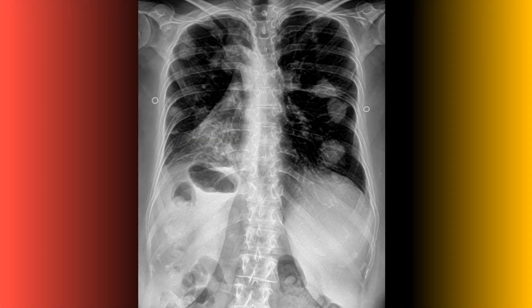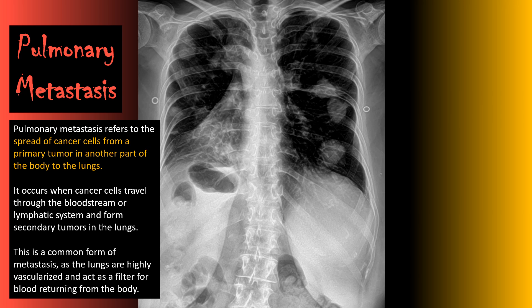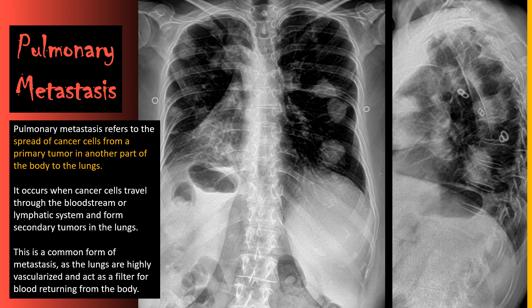In this example you should see multiple areas of increased density scattered throughout both lung fields without obvious evidence of calcification. Anytime you see that, think pulmonary metastasis first. Pulmonary metastasis refers to the spread of cancer cells from a primary tumor in another part of the body to the lungs. Due to the high vascularization of the lungs, this is what pulmonary metastasis looks like on an x-ray.